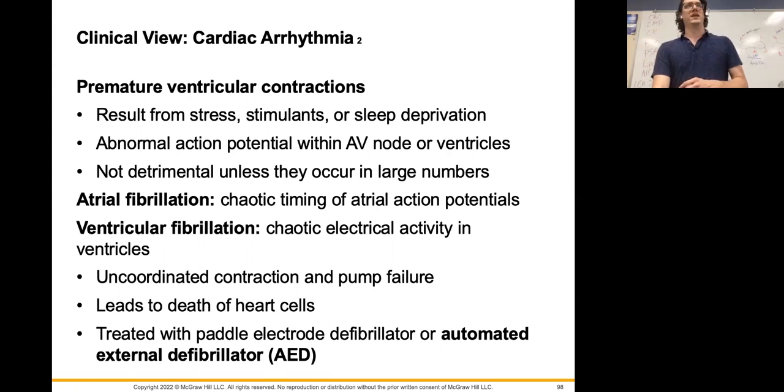Now, if anyone has ever seen a defibrillator, I think there may actually be one in this building over there by the door, or at least they were talking about installing some. These are basically a way of telling the heart to calm down and start beating normally again. Okay, so oftentimes when people start to have these kinds of crazy contractions and the signals aren't right and they're getting out of order, sometimes you can literally shock the heart.